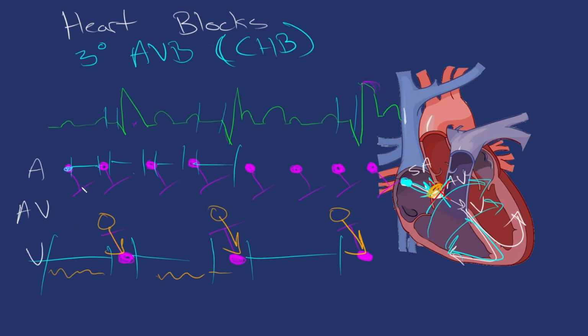But it still wouldn't be related to the sinus portion. So even though there could be a wide or narrow complex for the QRS, that doesn't necessarily mean whether or not there is a heart block. That just means which portion of the AV node and the His-Purkinje system that block is happening in.